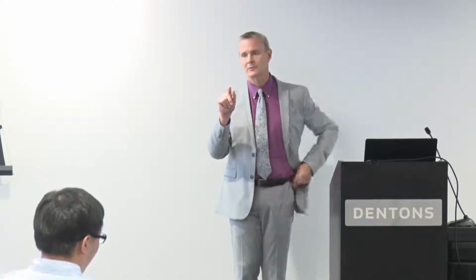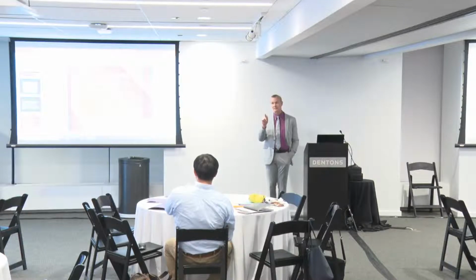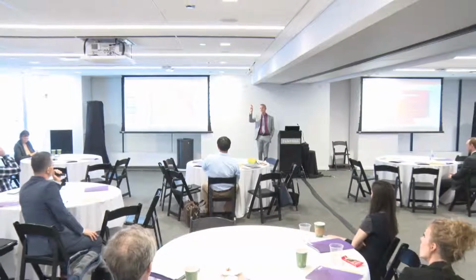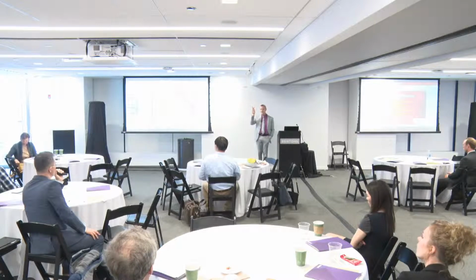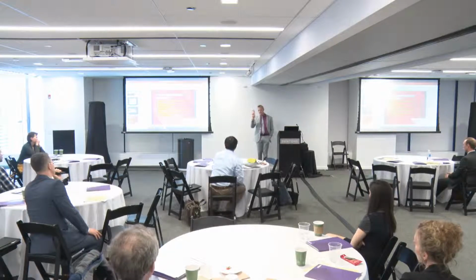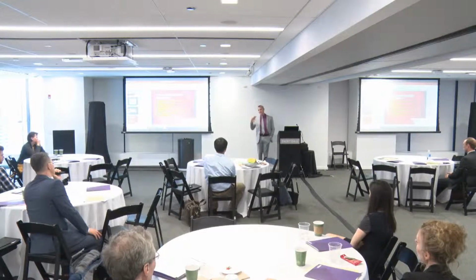We can preset our system, and I think the low MI on the Philips does preset to 0.18. Now the problem on the Epic we saw, yes, it presets to 0.18, but it sets the flash to like 0.5. And that's not going to do a real good job of clearing the myocardium in certain circumstances, especially during stress. So we had to preset that up to 1.0 again. So the flash MI, remember on the upper right portion of the screen, it gives you the MI and then the flash MI. Now the MI around 0.18 seems to work for the Epic transducers, the newer versions. But the flash MI, we had to adjust back up to 1.0 to get good clearance.